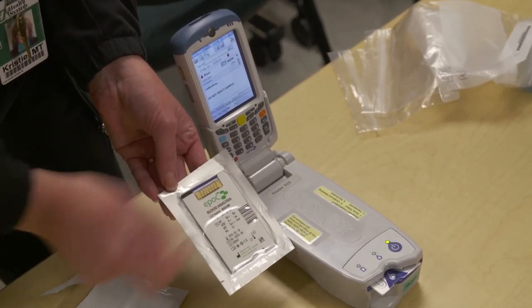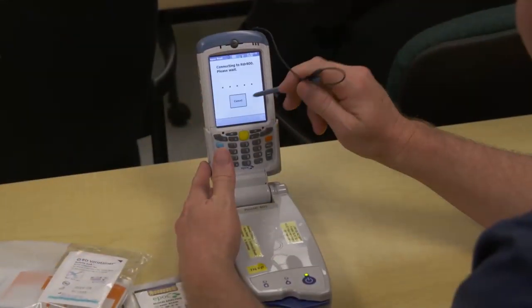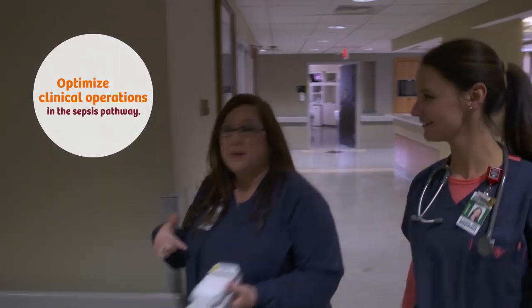It helps them monitor the patient's status during their procedures and post-procedure, so it's very integrated into our entire continuum of patient care. If you have any patient population where blood management is crucial, then a point-of-care device is very useful in those types of settings. It can provide a quick result on a very small amount of blood, and that is really important in some of our patient population. We are starting a new process where we're going to screen our patients on the floor for sepsis. The patient can look and actually feel okay.